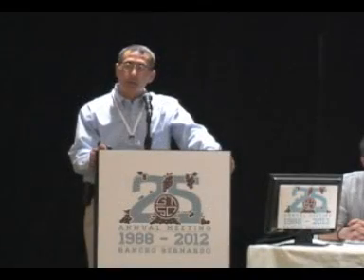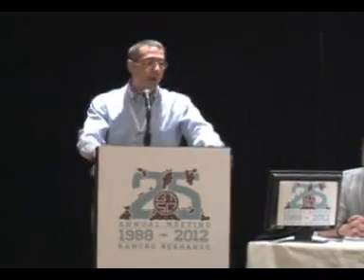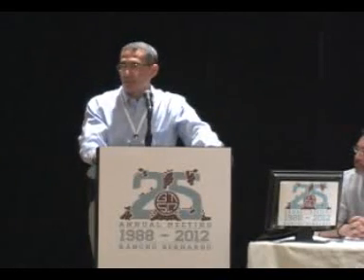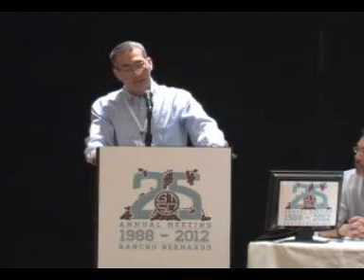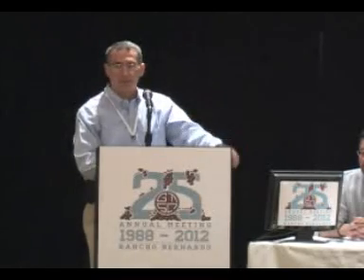You need very small cannulas, you need very small flows. The devices that we're working on right now are probably going to flow somewhere between 300 and 800 cc's per minute. That's essentially dialysis. And the cannulas that you're going to need are probably going to be a little bit bigger than your VasCath. I could tell you, but then I'd have to, I can't tell you actually because of agreements that I have. But it's going to be small and it's going to work. As I said, we're doing the feasibility trial at Columbia right now and we're about to enter into a larger trial.